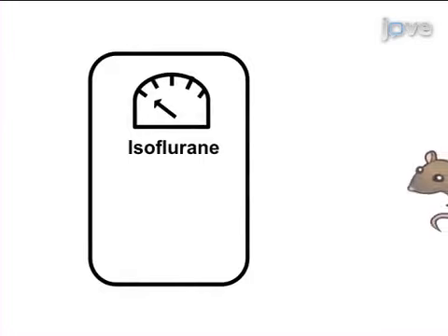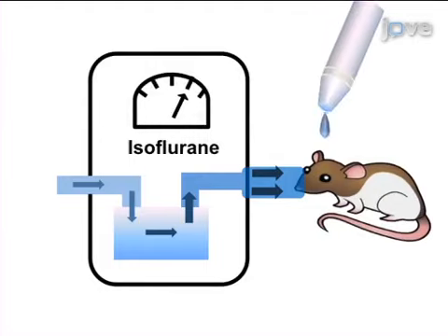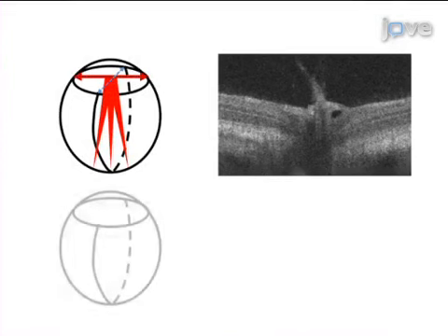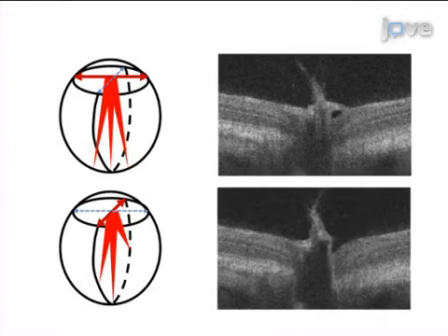This is accomplished by first preparing an anesthetized animal by dilating the pupil and paralyzing the iris sphincter muscle. Then, real-time SD-OCT cross-section imaging is used to locate the retinal region of interest and to optimize the optical parameters.